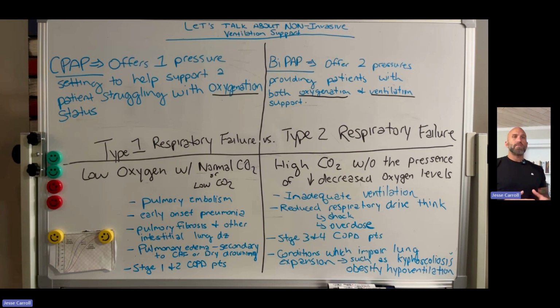So this really prompted me to develop this educational video for you guys today, in deciphering that we have a large gap in that pre-hospital space where most of our agencies and services have the ability to provide disposable CPAP, which is under high pressure oxygen delivery sources that most of the time have large leaks and can't really control the high amounts of fractional inspired oxygen that they're delivering to the patients. And then they have a pneumatically driven mechanical ventilator that occasionally tries to deliver BiPAP.